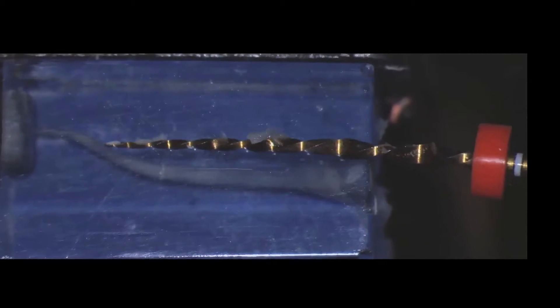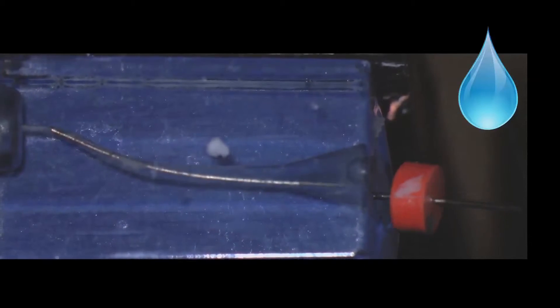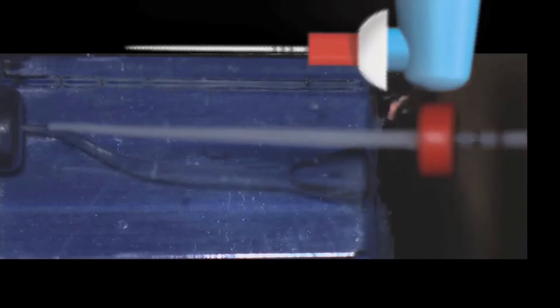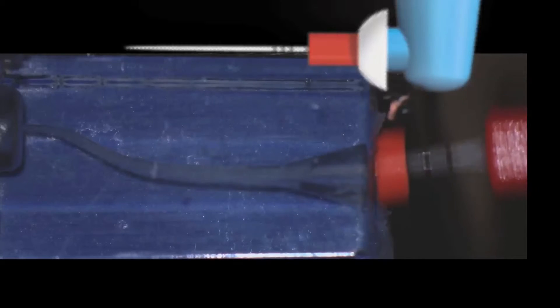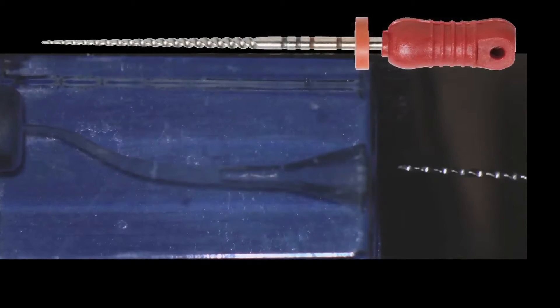You can see the efficiency of this file in conventional cuts. We clean the instrument and irrigate with the needle as deep as possible — the needle must always be loose in the canal; it can never be lodged inside. We irrigate and once again ascertain we have not blocked ourselves with the small instrument used to establish working length. After that we proceed through the irrigation procedures, using the EndoActivator with sodium hypochlorite, then rinsing the canal, and then using other solutions such as Q-Mix or EDTA.